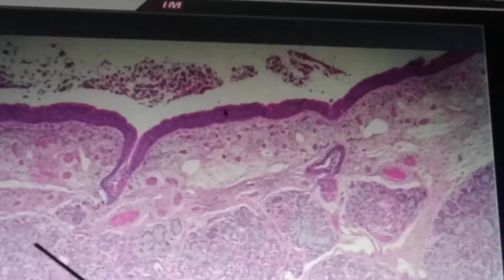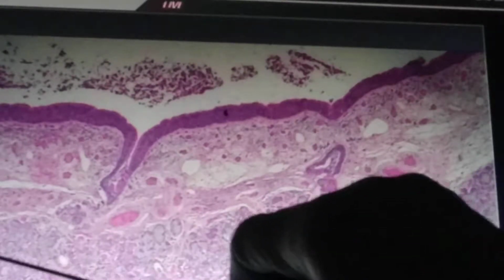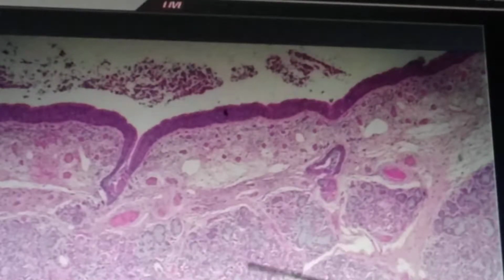Underneath, in the lower layer, you're going to find the submucosa, and the submucosa has some glands that secrete mucus. It is shown up here. I'm going to put it a little higher so you can take a look at the other layers that we know.